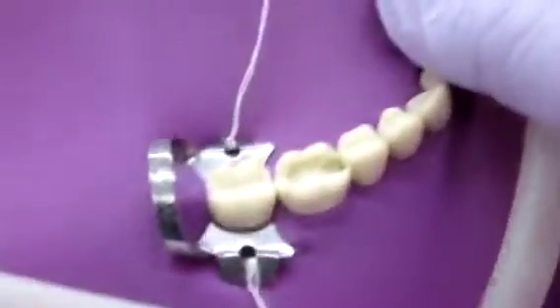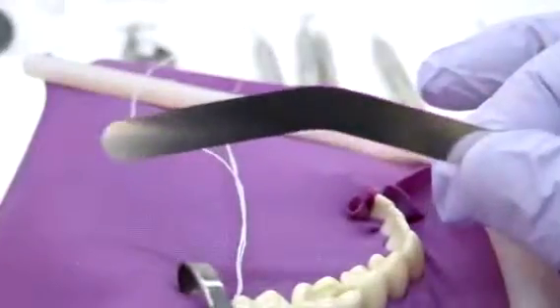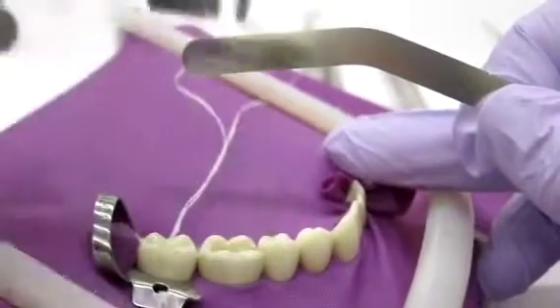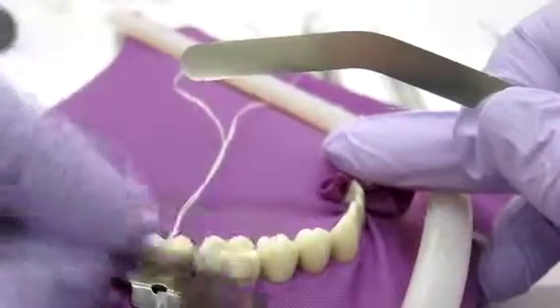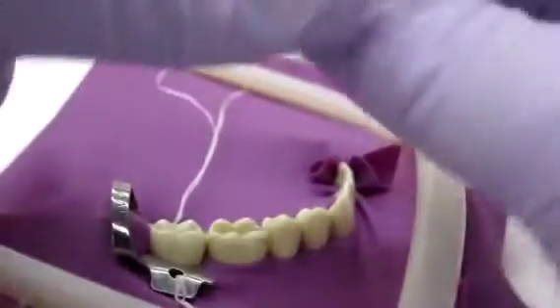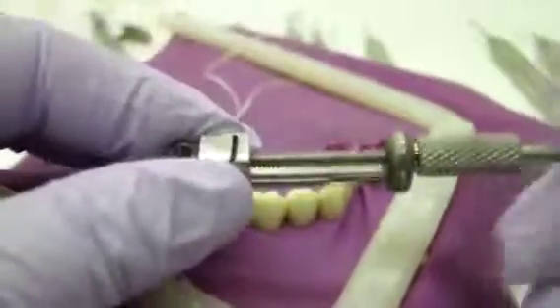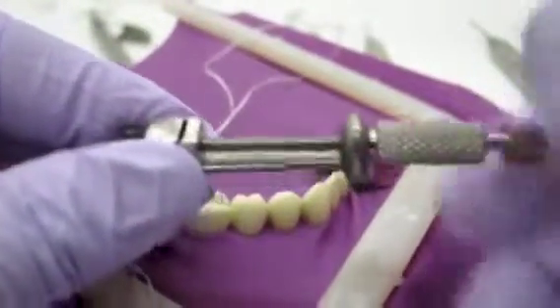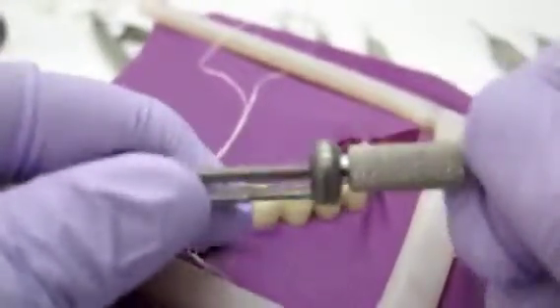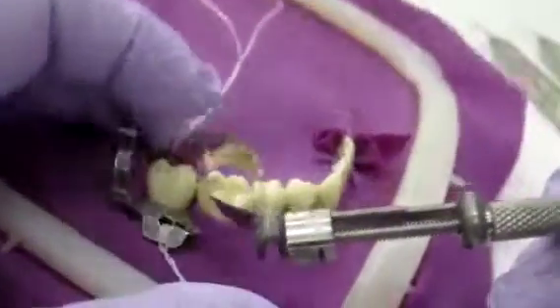First thing you want to do is put on your matrix band. This is how I remember — it's kind of like a U, and a U. The U goes towards the gum, so that when you pull out, you're not hurting the patient. Because if you put it on the other way, you're going to have to push into the gums and that's kind of painful. So U and U — fold it in half, slide it in, and pick which side you're going to put it on. Tighten the last small knob so that it holds the matrix in place, nice and tight. Kind of bend it a little to get a little more shape to it, and then place it around the tooth.